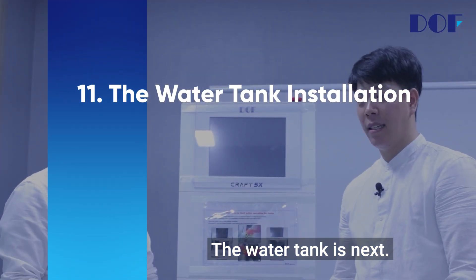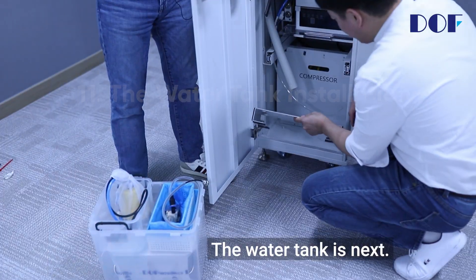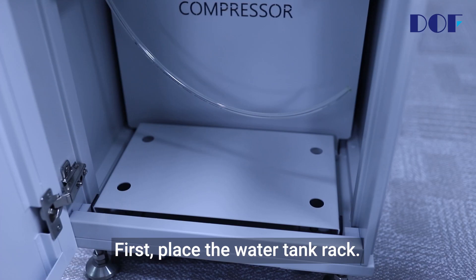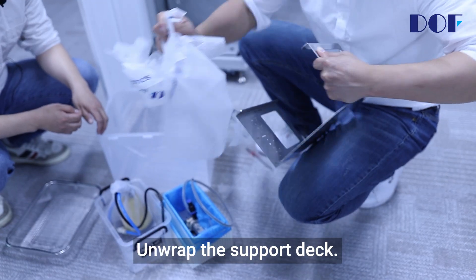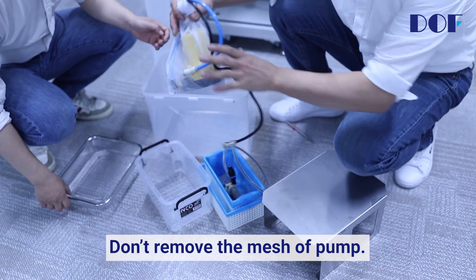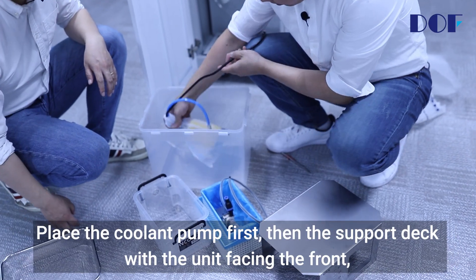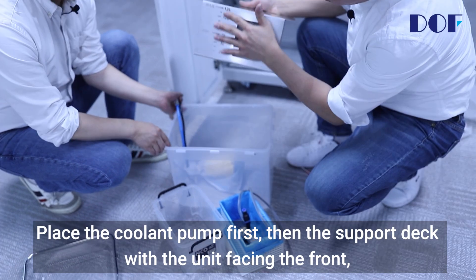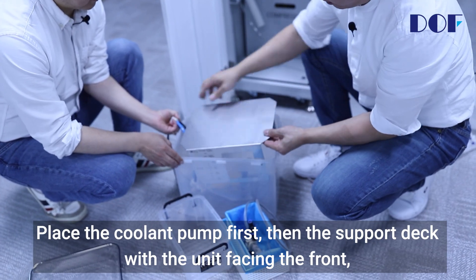The water tank installation is next. First, place the water tank rack. Unwrap the support deck, but don't remove the mesh of the pump. Place the coolant pump first, then the support deck with the unit facing the front.